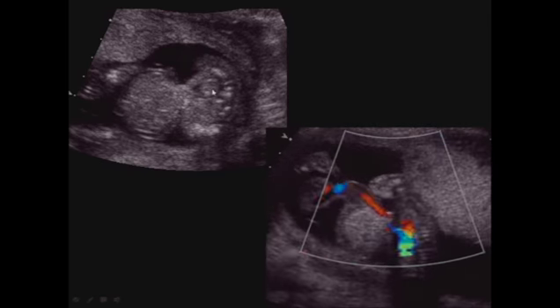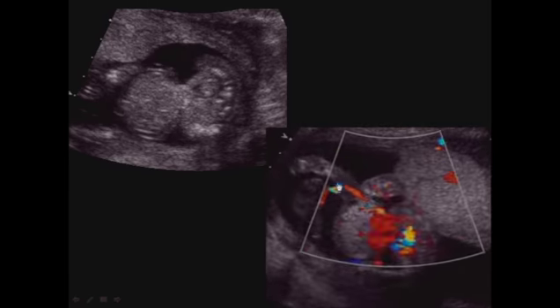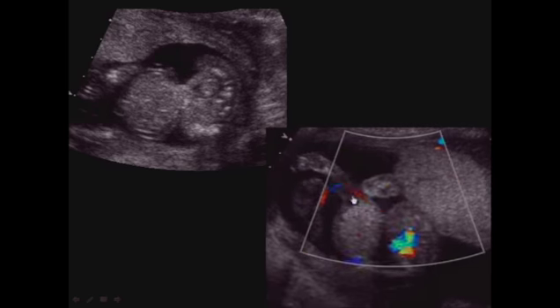Another example of a fetus with an omphalocele. Here's the fetus here. You can see some spine back here. And notice this enormous omphalocele, almost as big or even bigger than the body of the fetus itself. And with the color Doppler, we can see that the umbilical cord runs right into the omphalocele and along the inferior edge of it. Well, we know we have to look around. Up in the brain, we can see a choroid plexus cyst. And when we went to look at the extremities, we had bilateral clenched fists. And everyone should be expecting that the chromosomes would indeed come back trisomy 18.